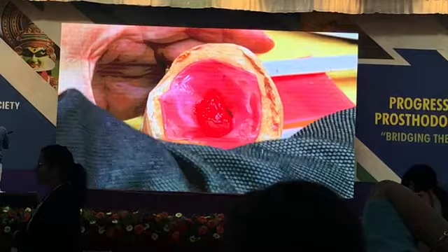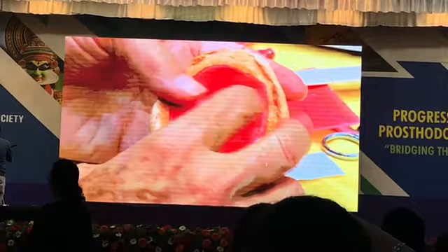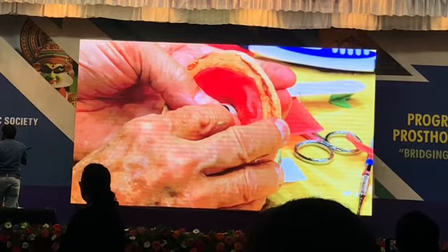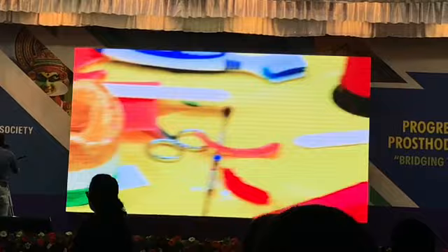And we'll just put the globe in a position that's reasonably comparable to that. And you see, this is why you need a hole in the back, so you can take your finger through there and you can manipulate it, move it around easily. So the wax that Dr. Beumer is using inside is your beading wax. The real soft wax. So you can move things around.